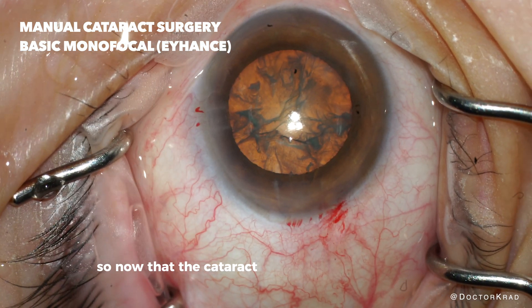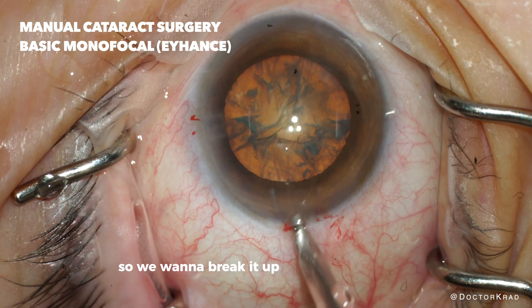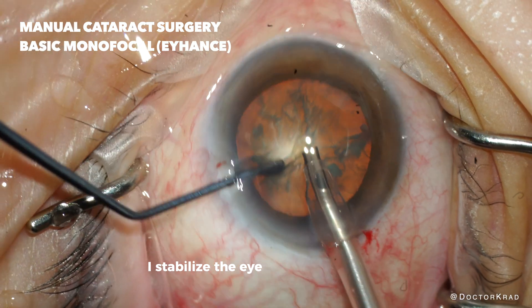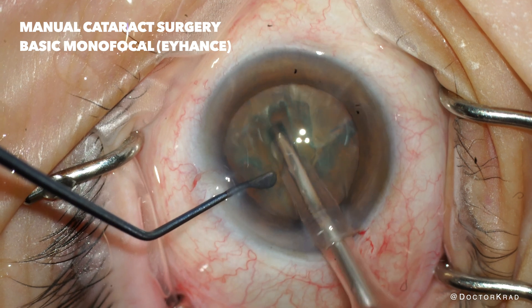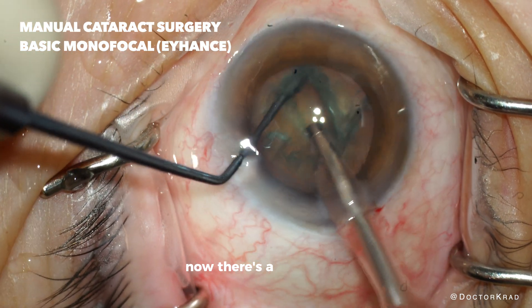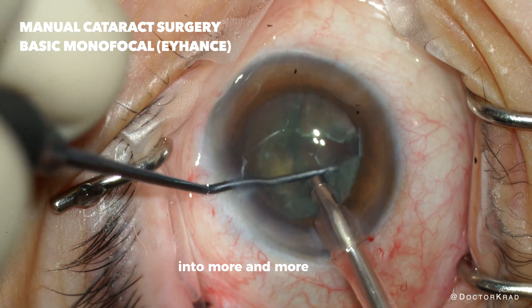Now that the cataract is loosened from its casing, the cataract diameter is large and won't fit through the incision, so we want to break it up into multiple pieces. We use ultrasound energy to accomplish that. I stabilize the eye with the left hand and use the ultrasound energy to create a groove or trench in the middle of the cataract, then separate the cataract into two pieces. Now there's a separation and I'm going to rotate the lens 90 degrees and separate into more pieces.